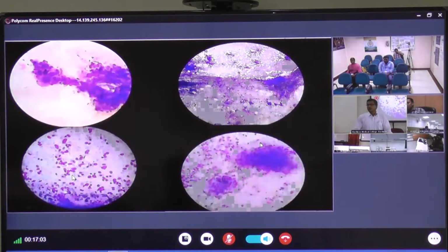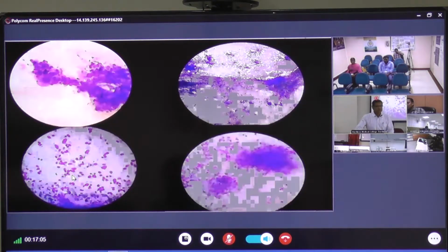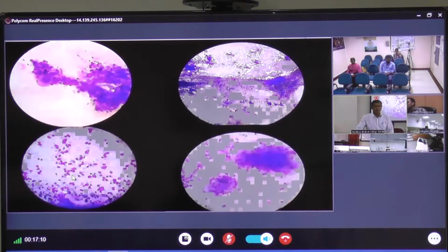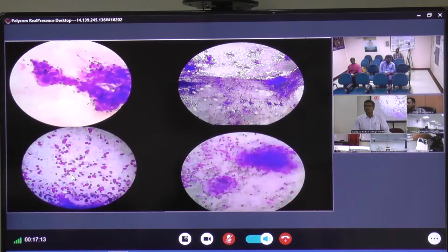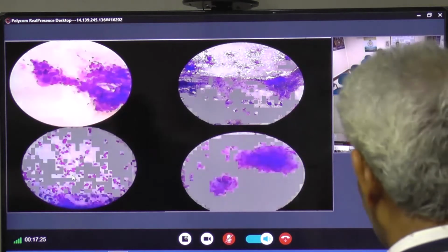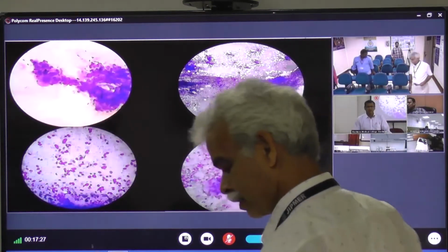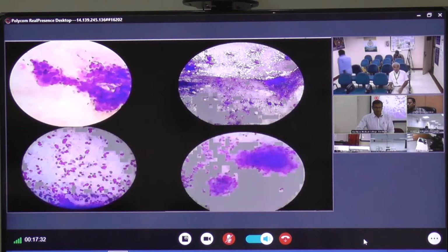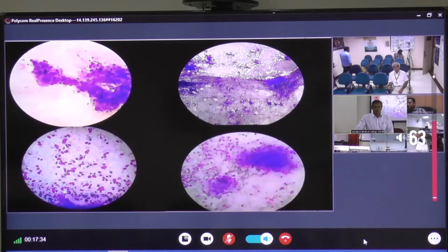So up to this, microscopic examination of cytology material provides us the nature of the lesion, whether it is neoplastic or non-neoplastic. When neoplastic, it is benign or malignant, epithelial or mesenchymal in nature. When non-neoplastic, whether it is a non-specific inflammation or has evidence of any specific infection like tuberculosis or fungal infection.